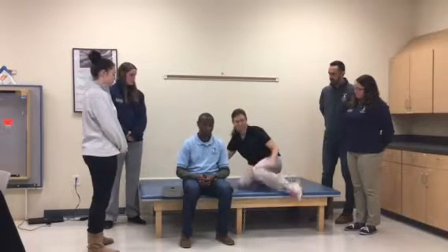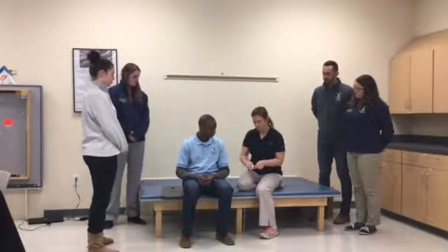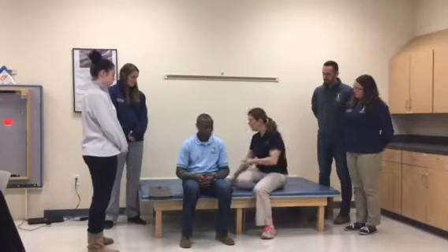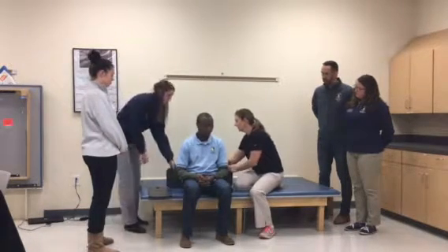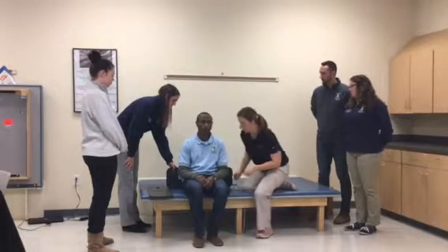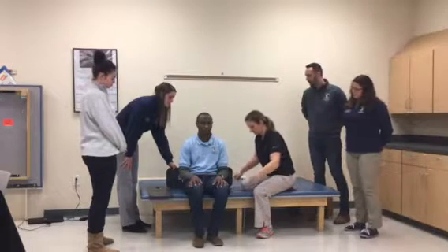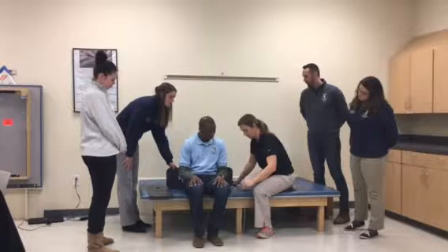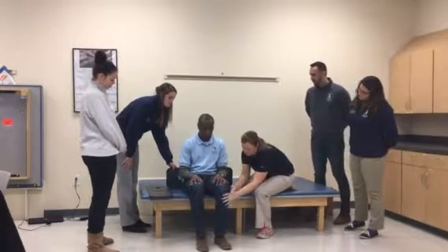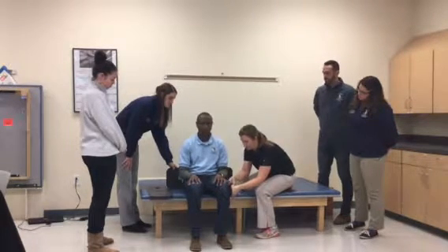The next measurement that we find vital would be the seat depth. It's helpful to know because if it's too shallow, it could cause the client's weight to shift forward and be less stable in the environment. So Melinda is now placing the sliding board behind Dixon, and she will measure from the surface of the sliding board all the way to the popliteal fossa. And we find it helpful to have the person's knee and ankle at 90 degrees.